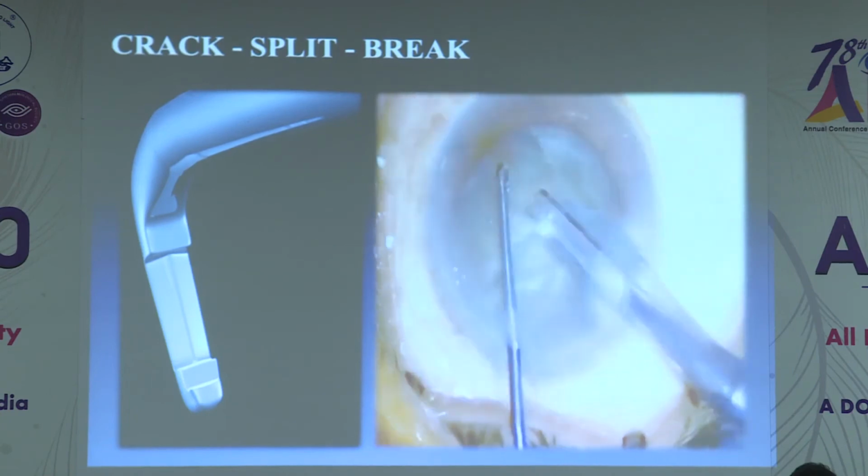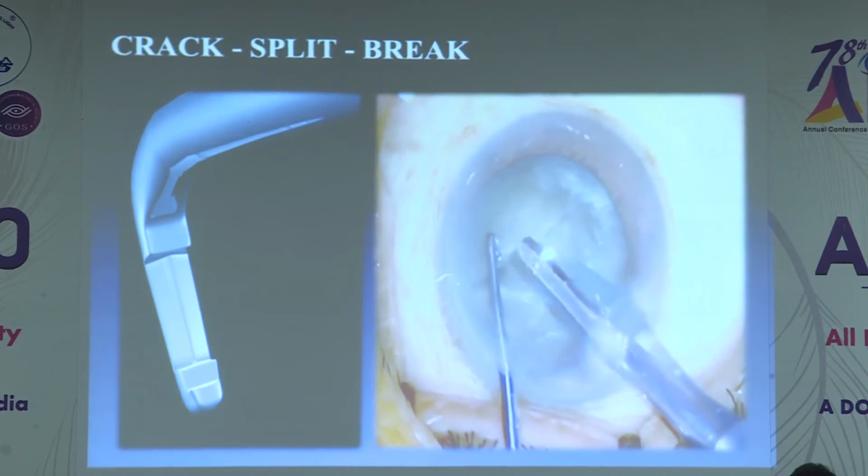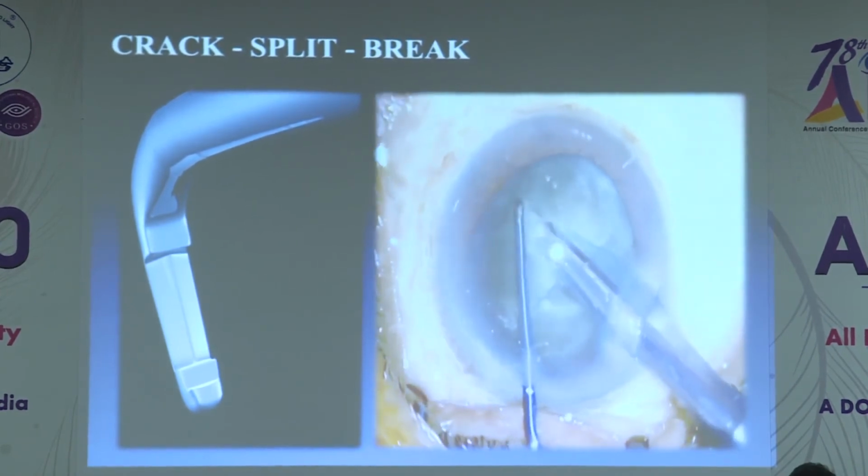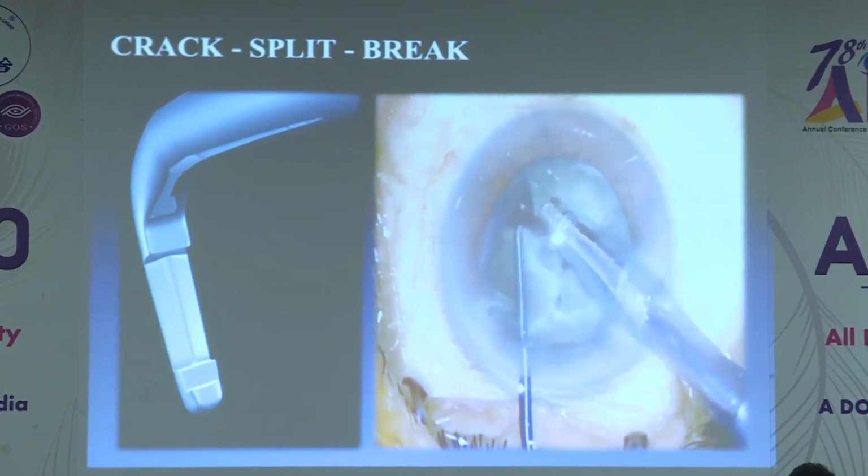That is the most important part, because in most cases or most techniques, when you attempt this hard cataract or rock hard cataract, you are always left with the posterior plate. And if you are left with the posterior plate, then comes the problem, because you are not able to break it, you have to go very close to the posterior capsule. And if you try to break that posterior plate of the nucleus, you may hit the posterior capsule with a sharp chopper or the phaco tip. So that is the reason you get into the problem of PCR and many of these complications. But here in this technique, you are absolutely safe.